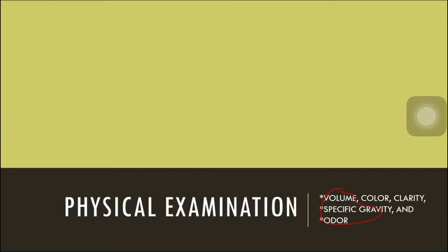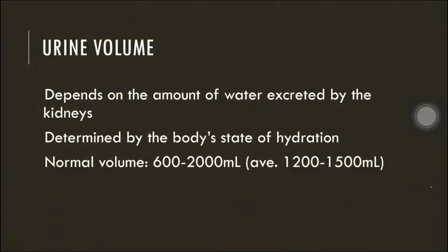For specific gravity naman, di siya kasama sa physical exam usually kasi doon na siya sinasama sa chemical examination. So ang routine part lang talaga dito is yung color and clarity. So let's talk about urine volume first.